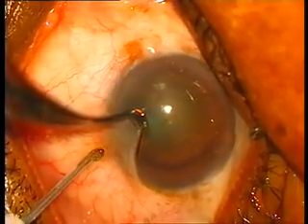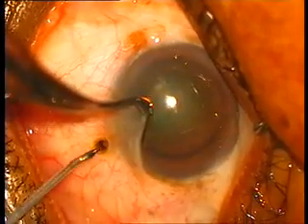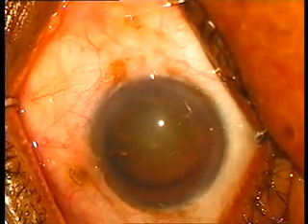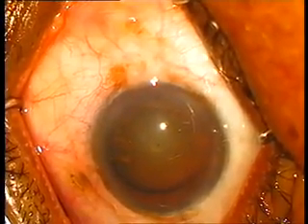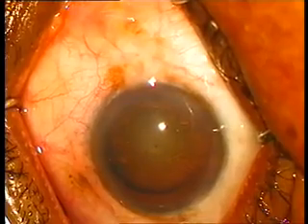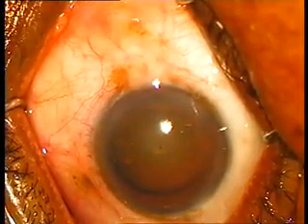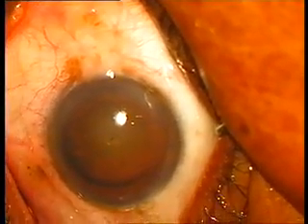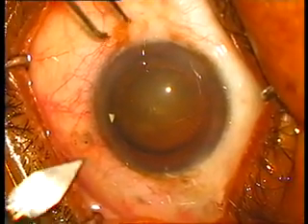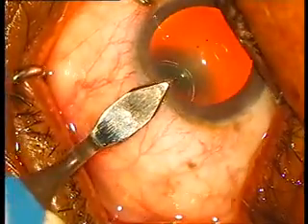So I am using a Fugo blade with a 300 micron tip to create a microtract filtration in the ciliary body or pars plicata region of the ciliary body. In other words, a transciliary filtration procedure is done in this patient, and now I will start with the Phaco to remove this cataract.